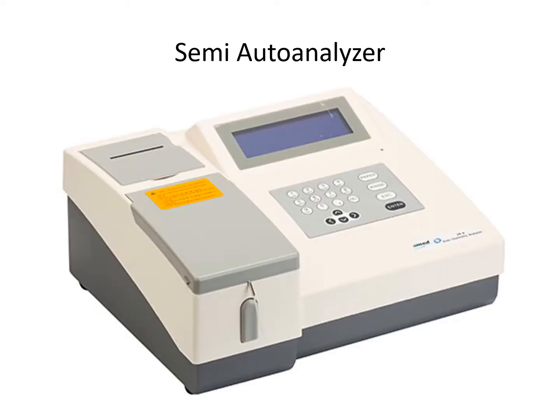See, analyzers are of two types: semi-auto analyzer and fully auto analyzer. Semi means half. Okay, so in this semi-auto analyzer, the lab technician, LT, plus the semi-auto analyzer will work together. Okay, this is the semi-auto analyzer.